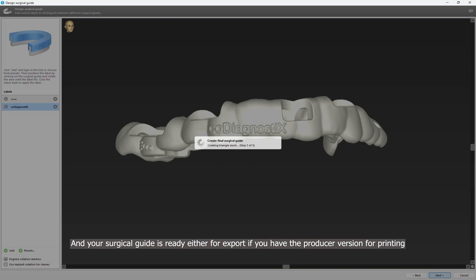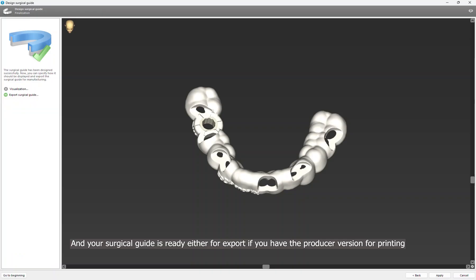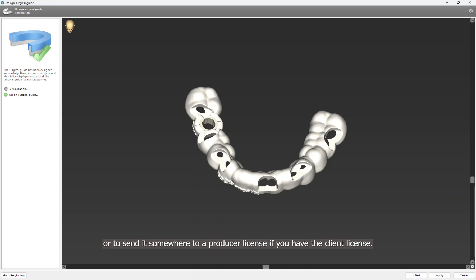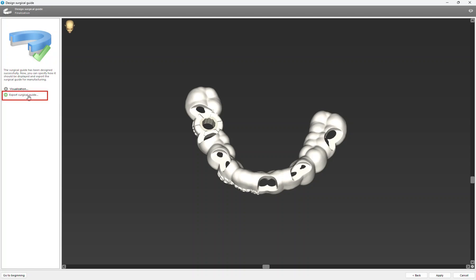And your surgical guide is ready, either for export if you have the Producer version for printing, or to send it somewhere to a producer license if you have the Client license. In this case, I will export my surgical guide.